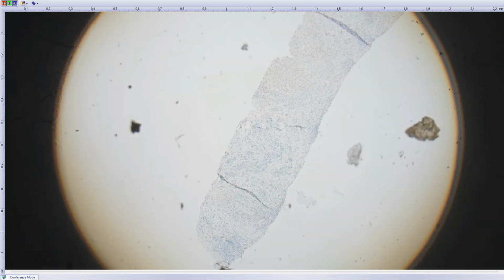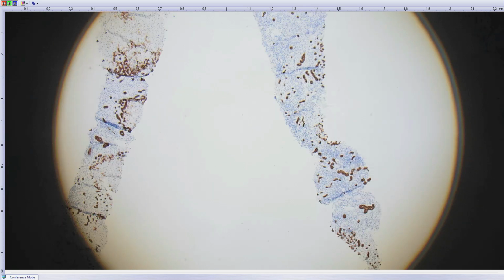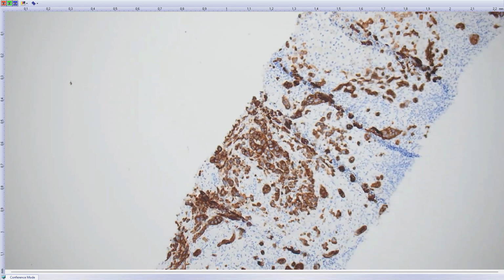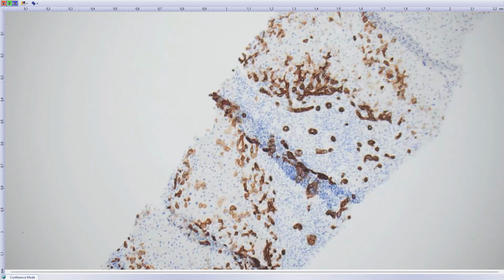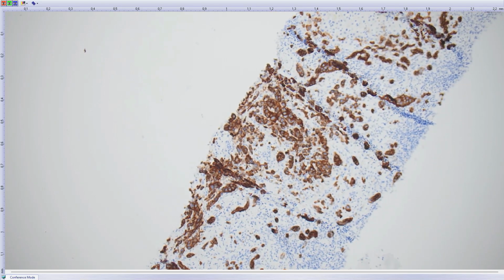And after a couple of other immunostains, including neuroendocrine markers, the positive immunostains were CK7 and CK19. So this is probably a primary cholangiocarcinoma metastasizing to the colon, which is the weird, vice versa situation from what we are used to. But these were the only markers positive.